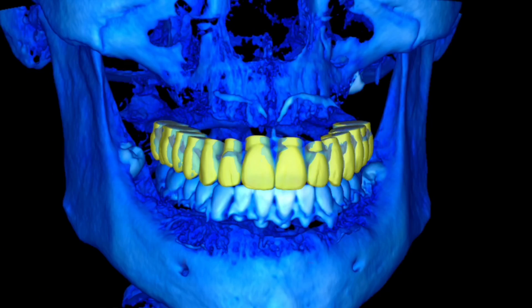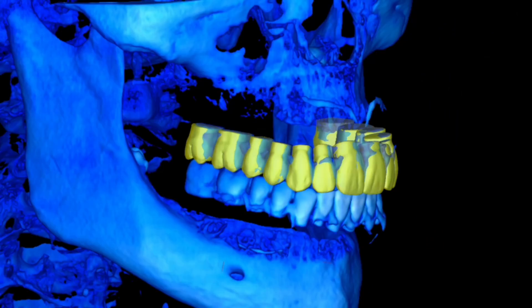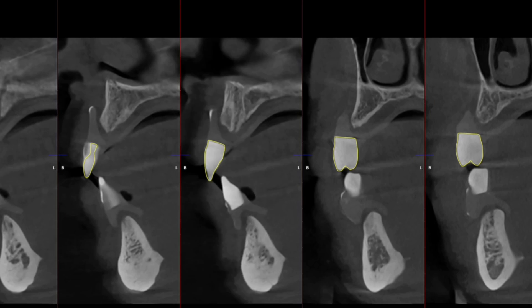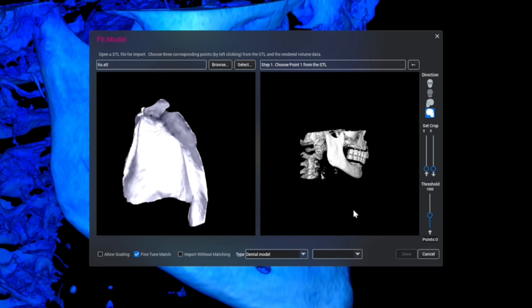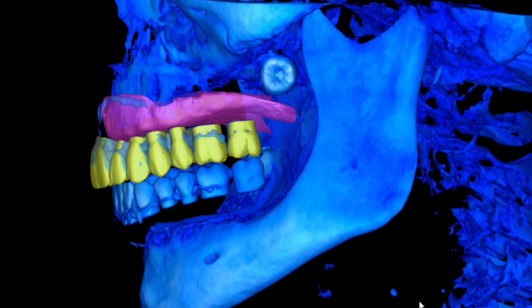And this is what you get — a much more accurate merge where you have a lot more surface area for the algorithm to use an iterative closest point to combine the digital wax-up to the actual patient scan. So there's no more scatter throwing things off like you have with the dual scan technique.